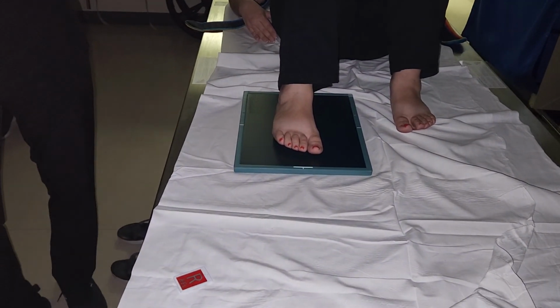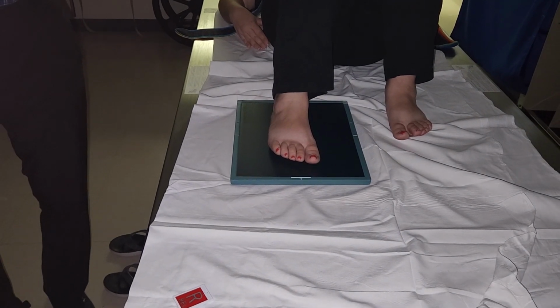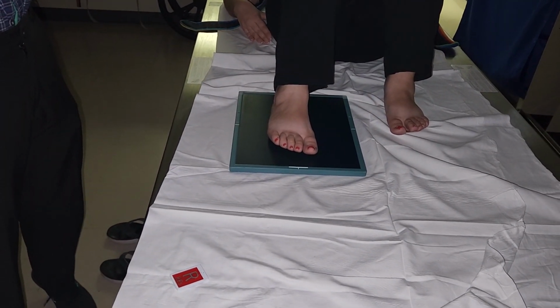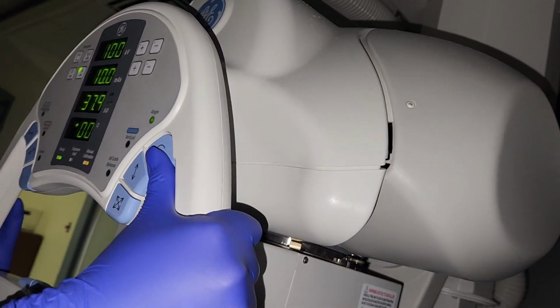This time it is 10 degrees. So what should I start my SID at? 38. Does everyone agree? Yes. Very good. So 10 degrees, 5 and 5, right? So we'll drop this down by 2 inches. All right, so 38, close enough.